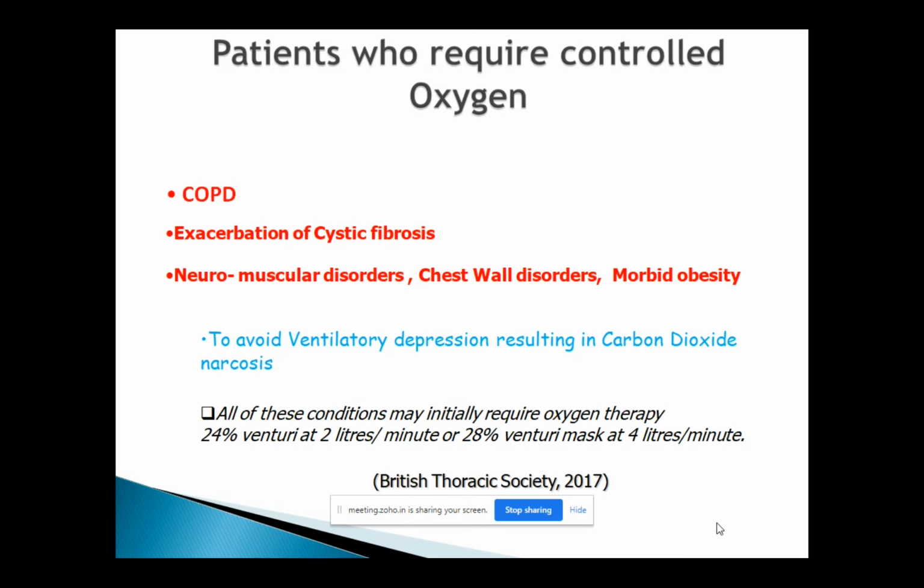Your next step is very clear: 28%, which is 4 liters of oxygen, which is your white valve. If they are not achieving that, then you can move on to yellow, which is your next step, which is 30% or 35%. So you've got very clear guidelines, you've got a clear idea what you are started with and how much you are going up. But again, the important thing is there's no point in going up and up. The medical team needs to be involved. Why are their oxygen saturation levels not going up?